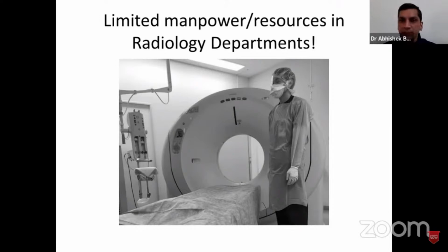The radiology departments were trying their best to sanitize these scanners after each scan, and the technologists were bearing the brunt, because the technologist was the first person coming in contact with these COVID-19 positive patients. He was the one positioning these patients on the CT scanner. He was the one actually holding their hands and doing the scan.